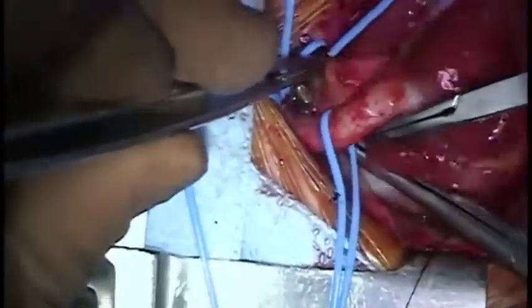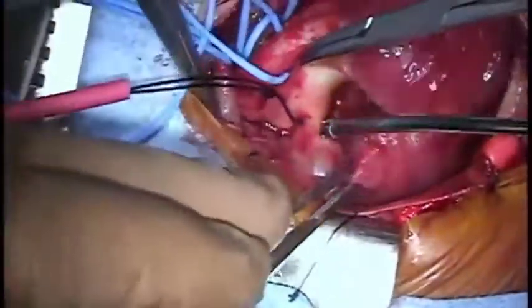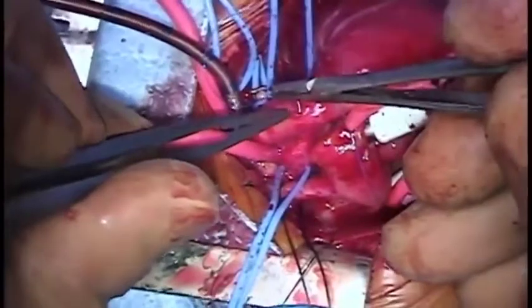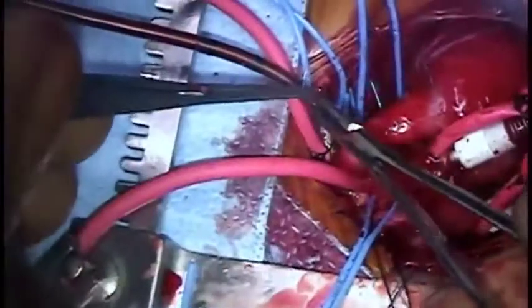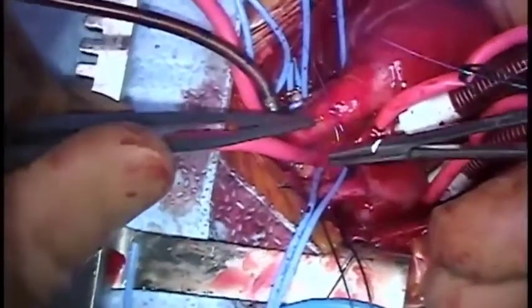Here you can see the right-sided ductus being controlled with a black silk ligature. This is snared to prevent pulmonary overcirculation after initiation of cardiopulmonary bypass. Cardiopulmonary bypass has been initiated and the patient has been cooled down to 14 degrees Celsius. Venous drainage is from the IVC and right atrial appendage in order to reduce crowding around the great vessels. The ductuses have been snared down.